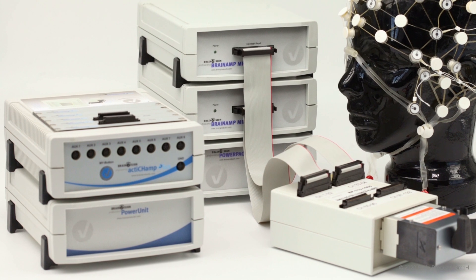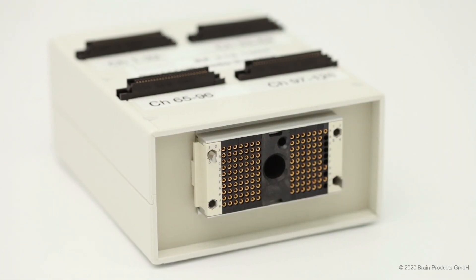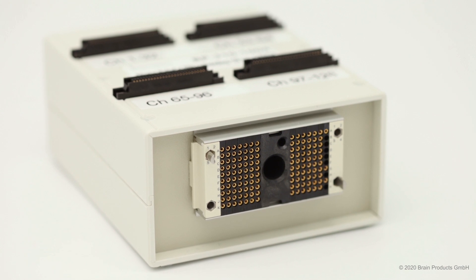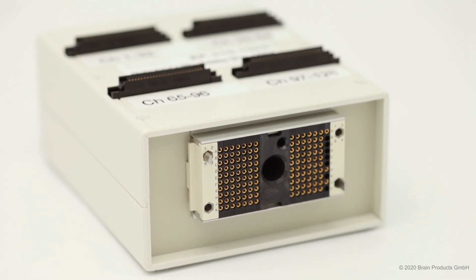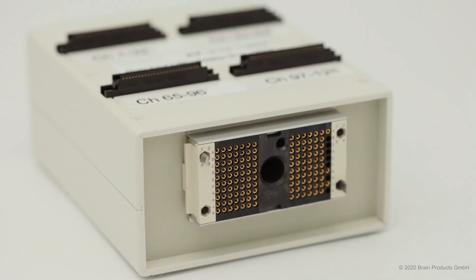If you're looking for flexibility in the number of channels for your experiments, you'll be glad to know that the 128-channel adapter can also work with 96, 64, or 32 channels only. Thus, only one adapter is all you need.